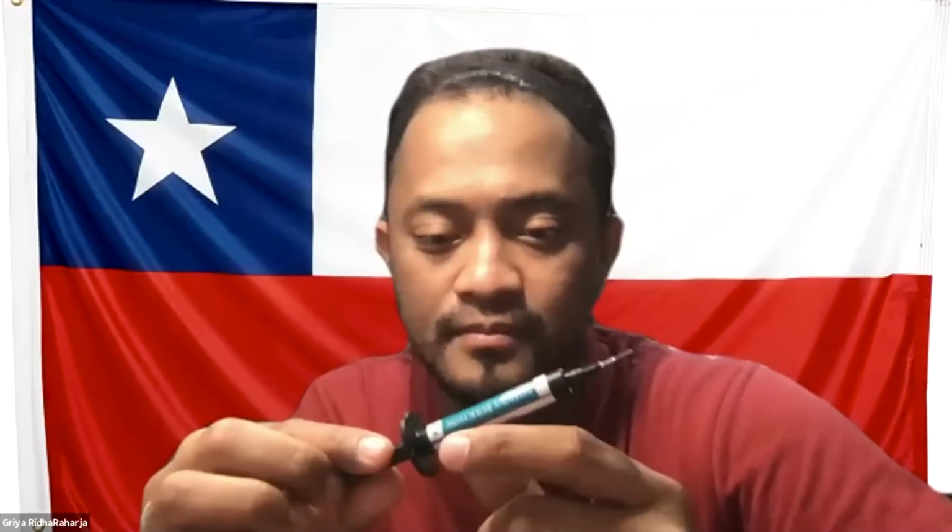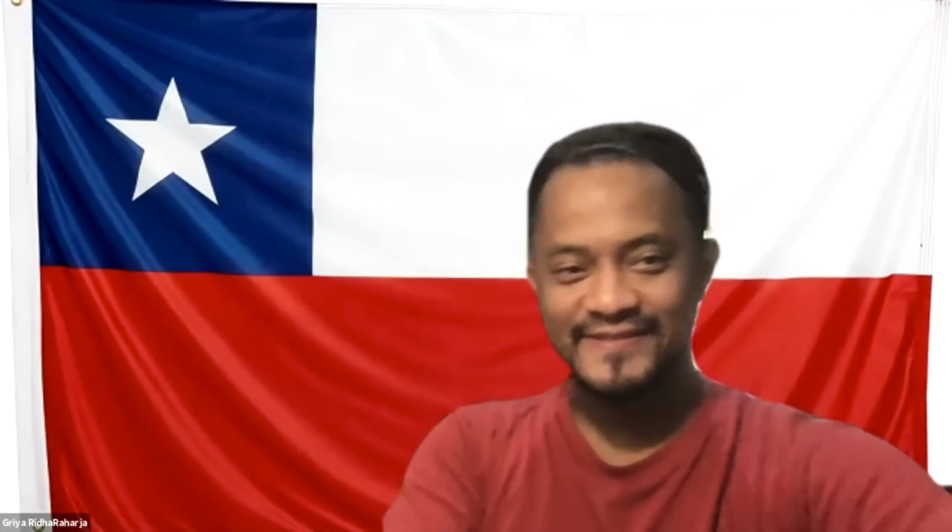So you can put this flowable, okay? Just backfill. Transparent. Backfill. I will type it. So in case your patient says, oh doctor, I don't want any cavity, don't bring my cavity back, you can replace it with the transparent. The idea is to cover all the gaps. So it's not mandatory to use stain. Okay. Let's continue. Another question.